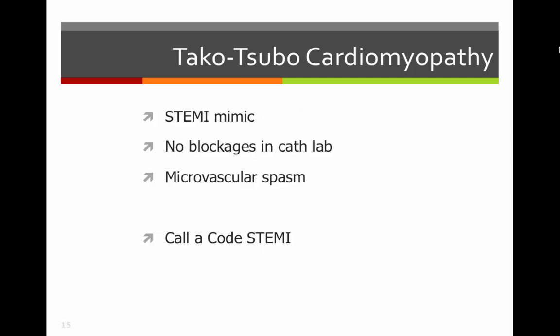In Takotsubo, this is one of those STEMI imitators, so it mimics a STEMI. You will see ST elevation on your 12 lead. So please, we are not going to be calling this Takotsubo out in the field. We need to call a code STEMI. We're not going to differentiate out in the ambulance in a 911 setting. But when we bring them to the cath lab, we're not going to find any blockages. The arteries will be clear, and this is due to just a microvascular spasm that's causing this ST elevation.